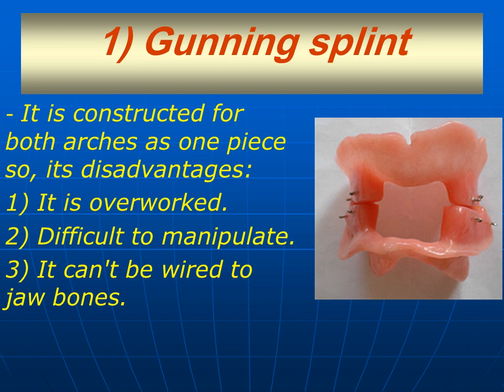تخيل كده لو السبلنت بالحجم ده وانت محتاج تحطه as one piece في فم المريض، والعين ده طبعا عنده fracture وعنده pain. الحاجة التانية لما تحطه كده هتعمل وايرنج ازاي؟ هتثبته ازاي في الجوز؟ الاب ر اوكي ممكن تثبته circumferential وايرنج، لكن اللور مش هتقدر تعمل circumferential وايرنج مثبت الستنت ده حوالين الماندبل لغاية ما يحصل هيل، وبالتالي it's not very effective.